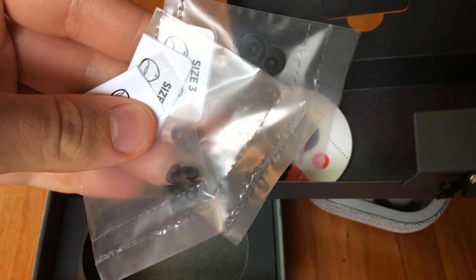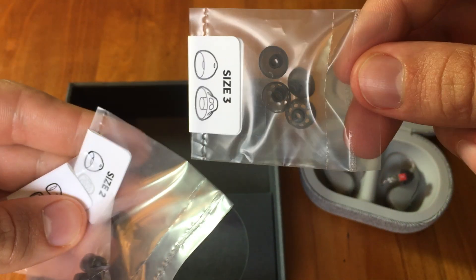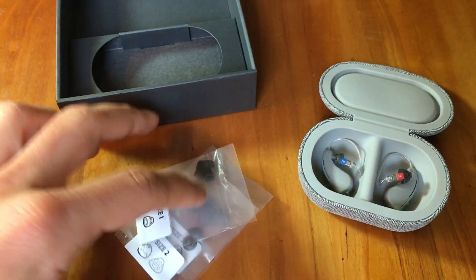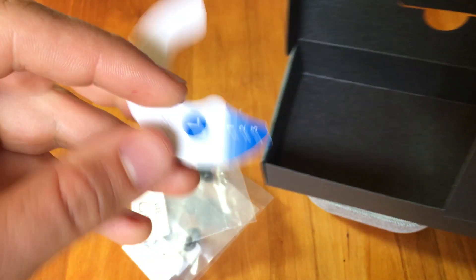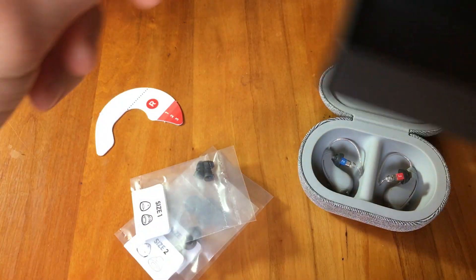Some different sizes of rubber tips are included. These are typically called domes — this is the piece that goes on the end of the hearing aid. And then we have an ear sizer to make sure you have the right length of the receiver wire in the ear.